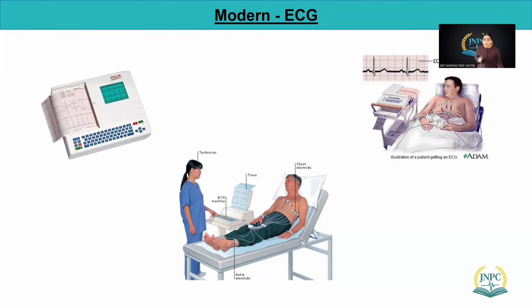In those kinds of scenarios, what can we do? Sometimes if you're working on a regular floor, for example a medicine floor, we don't have enough equipment. This client was not a cardiac client. A cardiac unit should have a lot of equipment where we can record that ECG. But on a medicine floor, we don't have a lot of cardiac monitors. So when your client is going out of control, we can always initiate the CCRT protocol, right? CCRT, critical care response team. We can call them, and they come with portable equipment. They'll do the ECG, and a lot of other things.